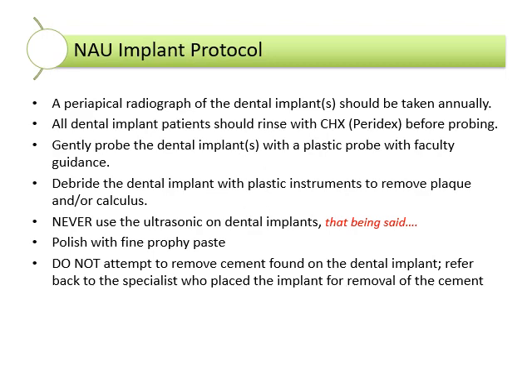The next 2 slides cover the NAU implant protocol that was developed a few years ago. Go ahead and read through these on your own. Just know that you're expected to probe around an implant, and again, we do have a setup of plastic instruments available for you. So if you know ahead of time your patient coming in has an implant, or you've seen the x-rays because you've looked ahead of time, go ahead and grab a packet of those plastic instruments and have them set up chair side, and go ahead and use that probe.